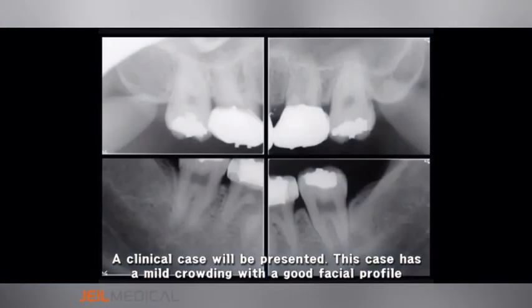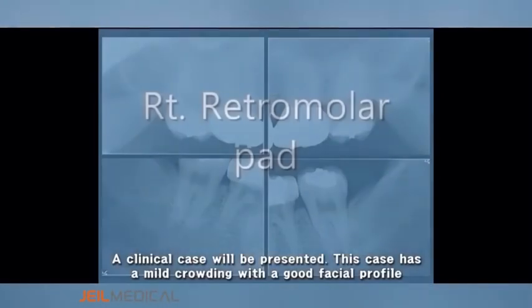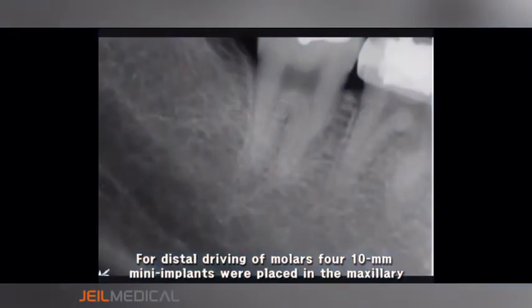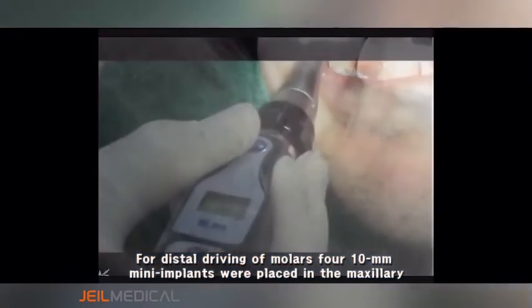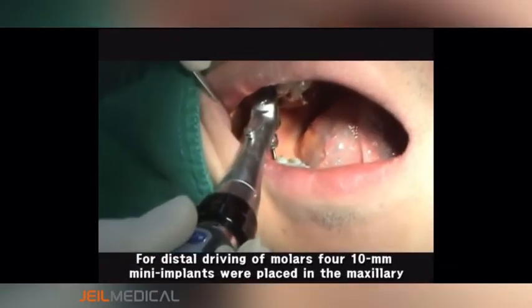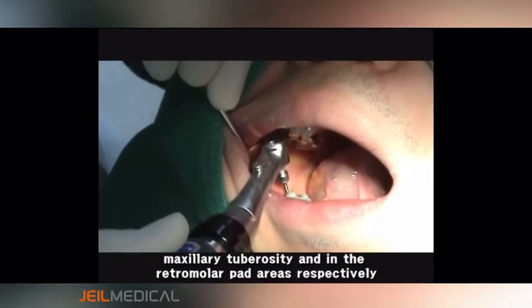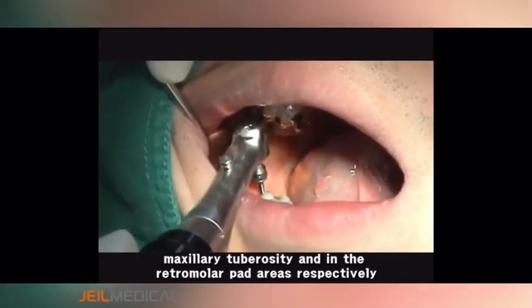A clinical case will be presented. This case has mild crowding with a good facial profile. For distal driving of molars, four 10mm mini implants were placed in the maxillary tuberosity and the retromolar pad areas respectively.